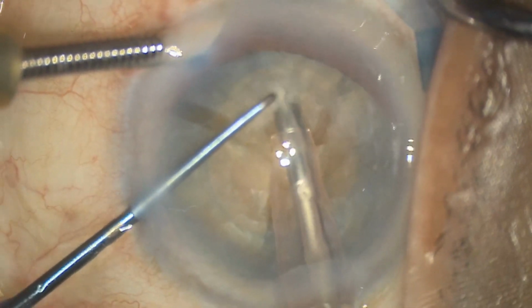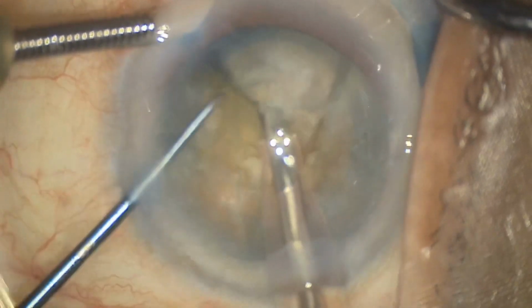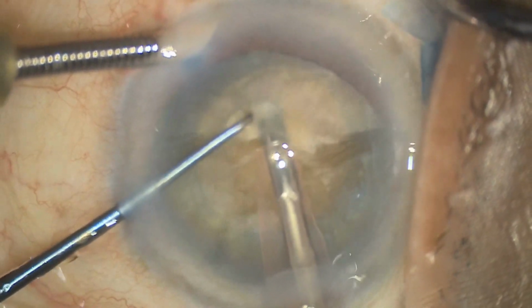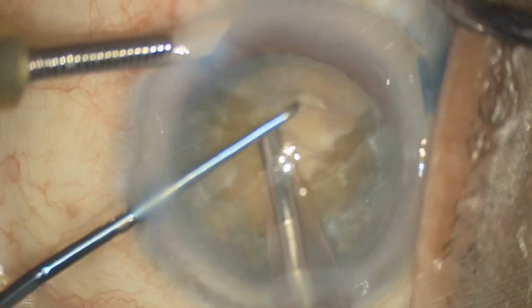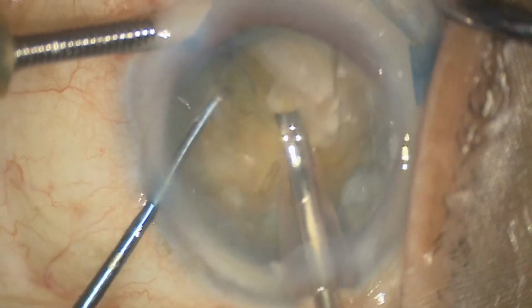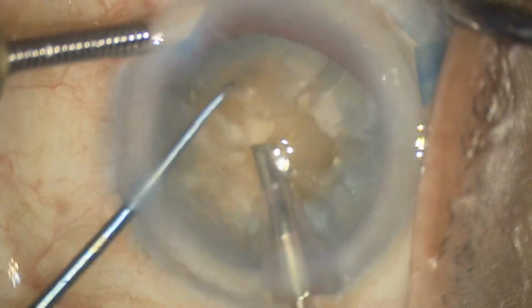Now we can break the nucleus into multiple fragments, 6 to 8 fragments. The number of fragments depends on the hardness of the cataract and the size of the CCC. If the cataract is hard, you make more fragments, and if the CCC is small, you create smaller fragments. To protect the endothelium, use dispersive viscoelastic substance appropriately.